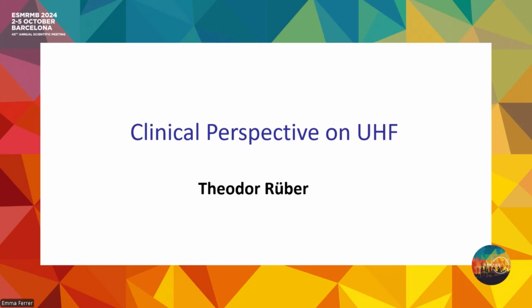Any questions for the clinician? Yeah, but I think it's really an important point, because we always assume that the main value of the field strength is the high resolution, but that of course is not all of it, right? So this is what I try to differentiate between detection, where resolution is probably the most important feature, and then segmentation and classification.